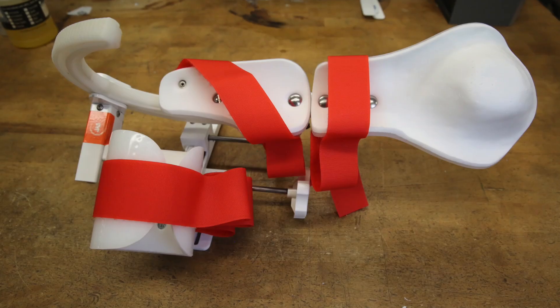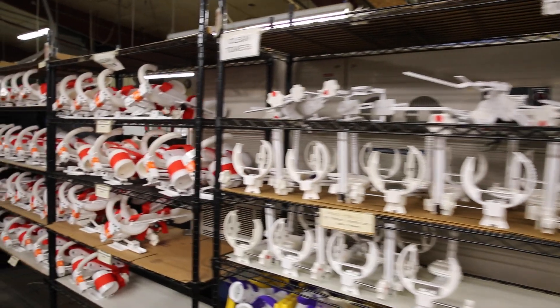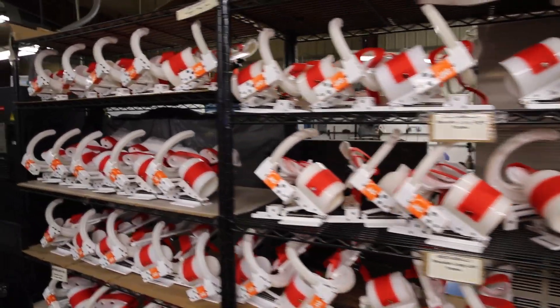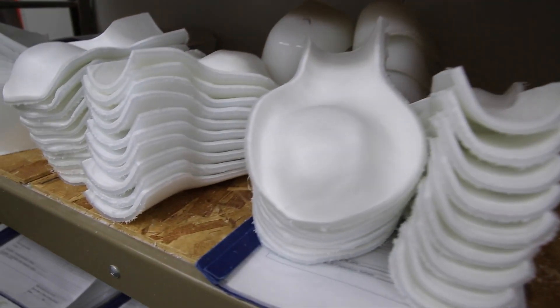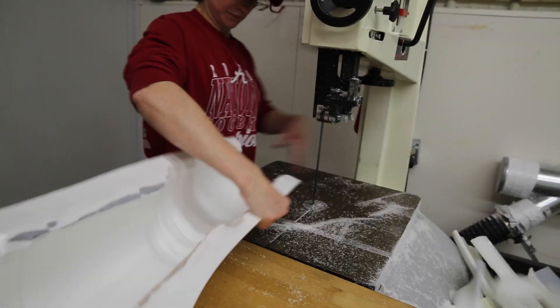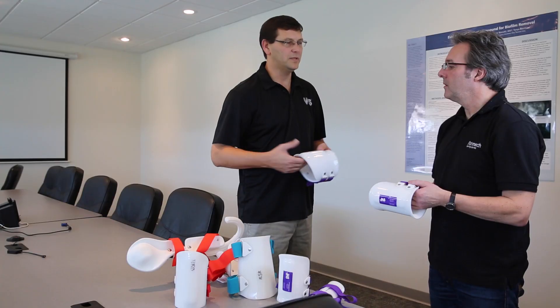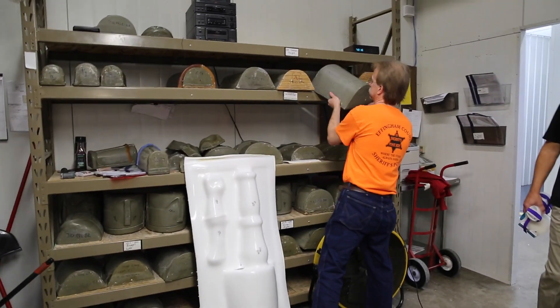This is actually a shoulder device. We supply cuffs for about 1,500 to 2,000 customers a month. Some devices take three cuffs, some devices take two cuffs depending on the device. Usually a therapist measures the patient for their sizes, and then we have sizing charts that the measurements are compared against to determine which size of cuffs.